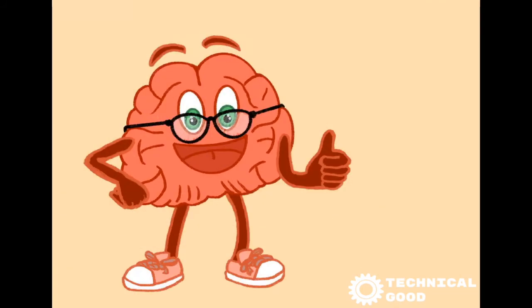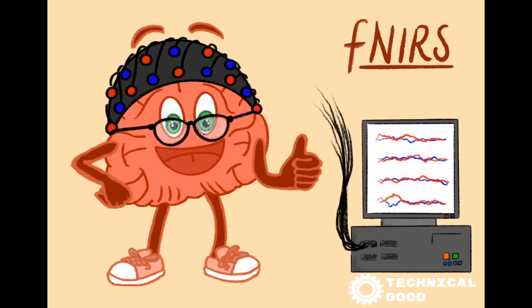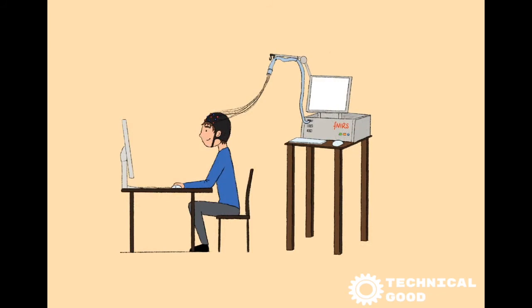So, now you know what the fNIRS does. But what is your part in a fNIRS experiment? And why is that important? fNIRS devices can record almost all of your daily activities. Thereby, it supports us brain researchers to find out which brain areas are needed for each task. Often, you will be playing a game on a computer while you're wearing the fNIRS cap.